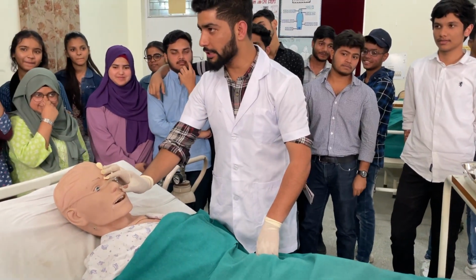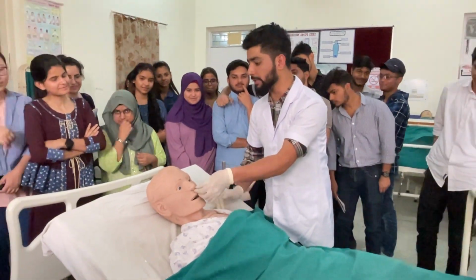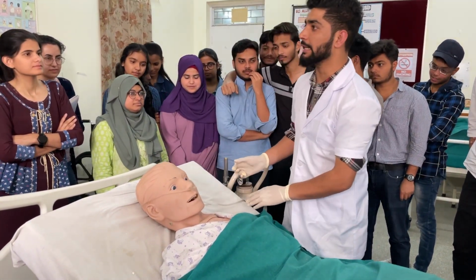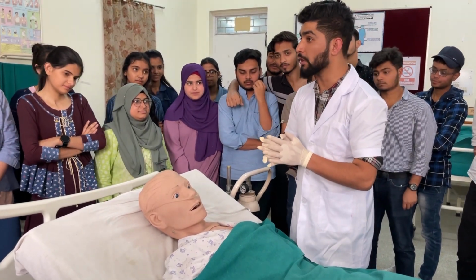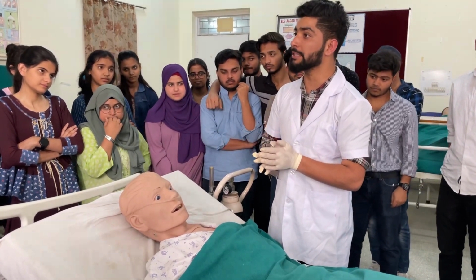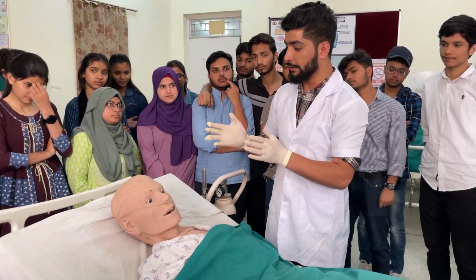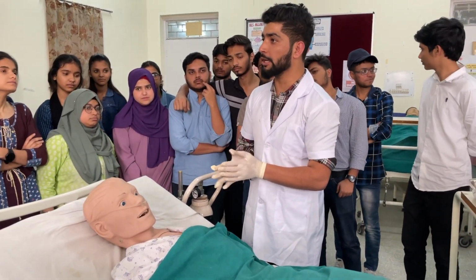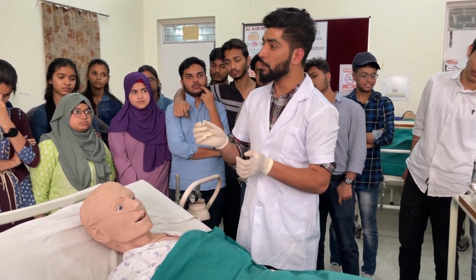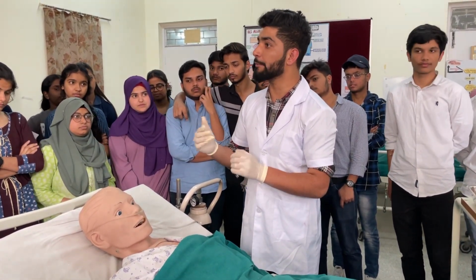After cleaning the nostrils, we have to put in these nasal prongs. We insert the prongs into the nostrils, and the tubing should be placed behind the ear, above the head. We have to maintain a constant oxygen concentration until the patient is comfortable. If the patient feels uncomfortable, we have to stop the oxygen therapy and inform the doctor. After that, we have to document what percentage of oxygen therapy we provided to the patient.